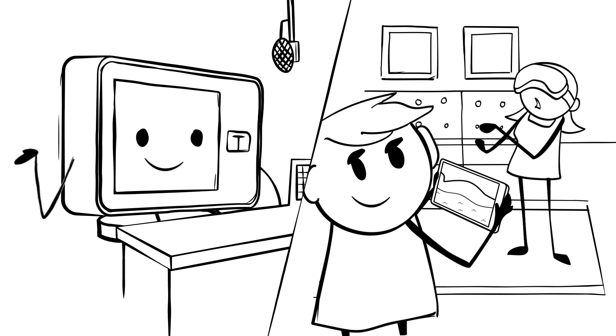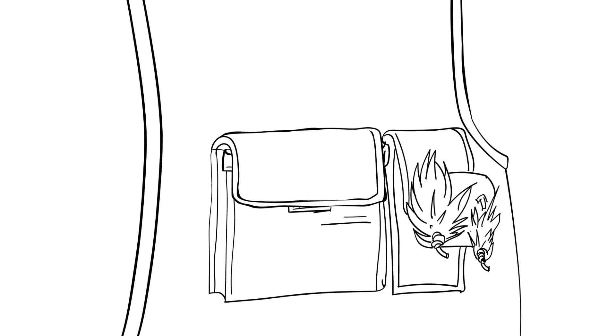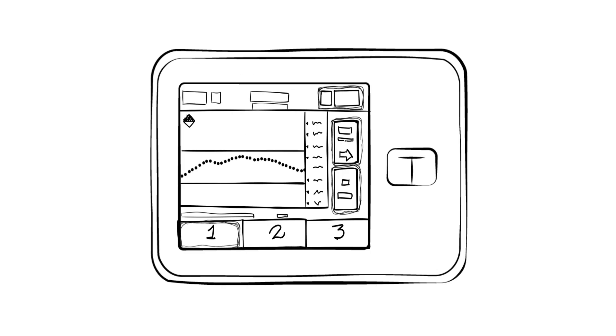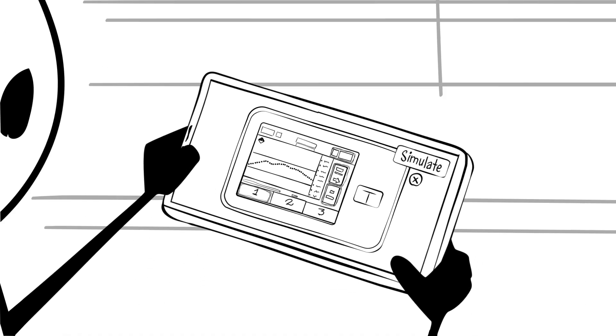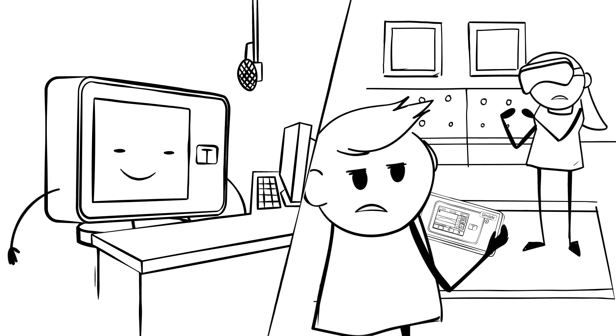If I may, Brenda — using the T-Slim X2 pump with Control IQ technology feels a bit like using a smartphone. The pump is small enough to drop in a pocket, and cool enough for the kids to show off. Plus, you can take the easy-to-use touchscreen interface for a test drive by downloading the T-Simulator app, which is a free, virtual pump demo. Poggers.